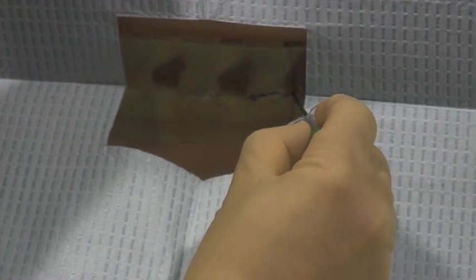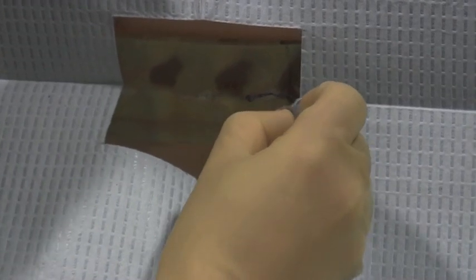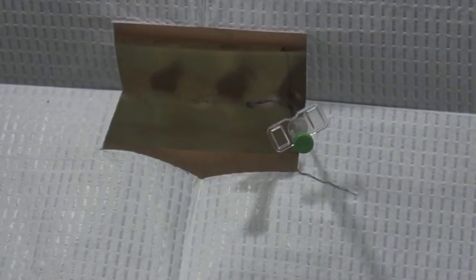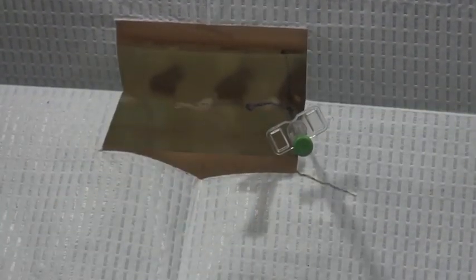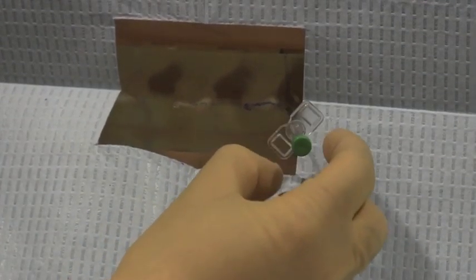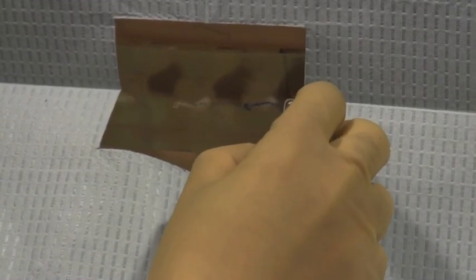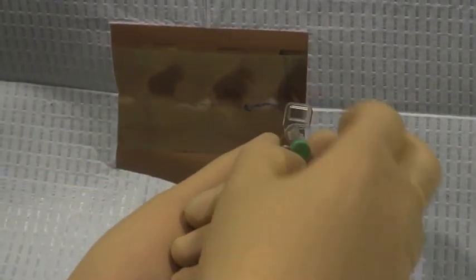The bevel is turned sideways during insertion. It will then be rotated so that the bevel is facing towards the head. This will guide the catheter upward in the thecal sac.